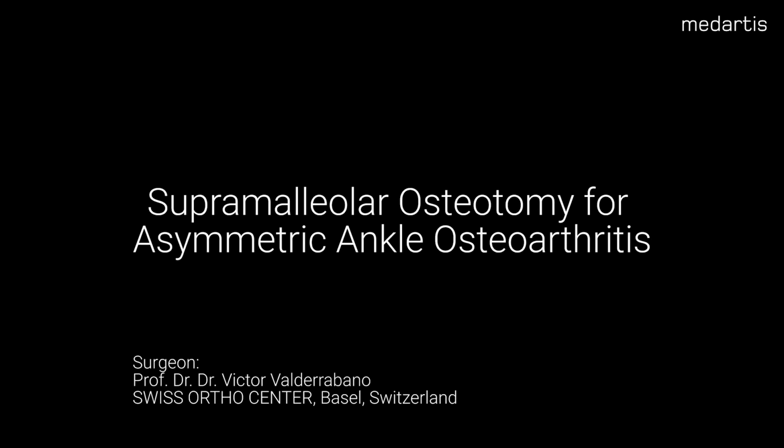Supramalleolar Osteotomy for asymmetric ankle osteoarthritis. Diagnosis.